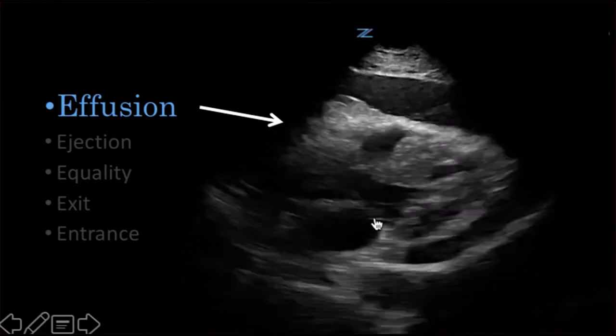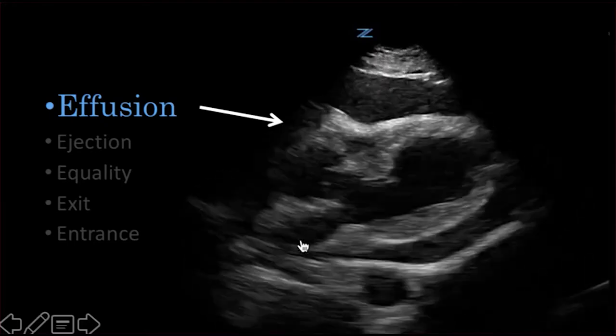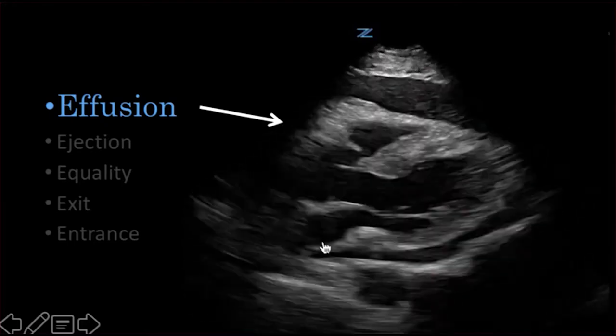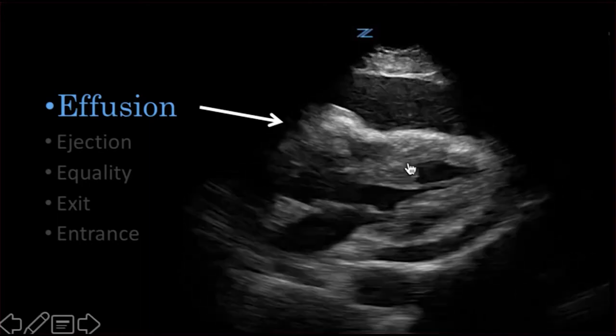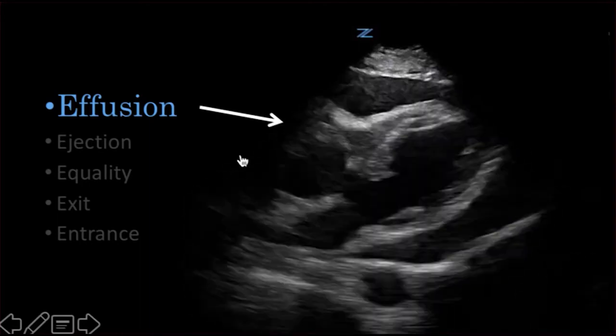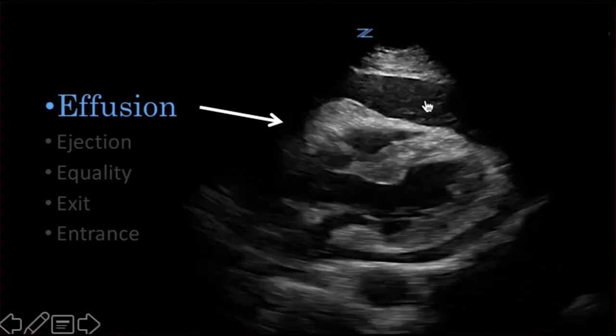This is a parasternal long axis view, which we'll get into more. There is fluid in the pericardial sac that surrounds the heart. And so for a little bit of anatomy, this is the left atria leading into the left ventricle, aortic outflow tract, right ventricle, descending thoracic aorta, and fluid around the heart.